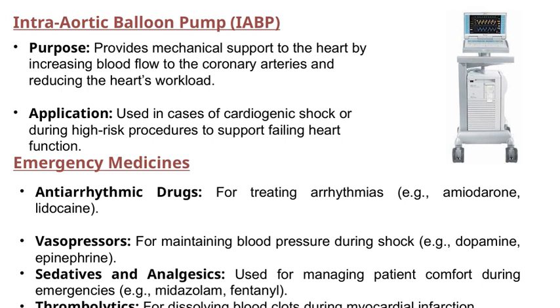Its main purpose is to provide mechanical support to the heart. It works by increasing blood flow to the coronary arteries, which are crucial for heart muscle nourishment, and at the same time, it reduces the workload on the heart itself. This makes it especially helpful in cases where the heart is struggling to pump effectively.